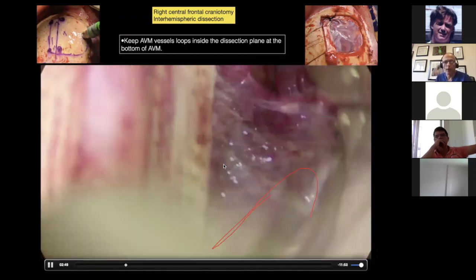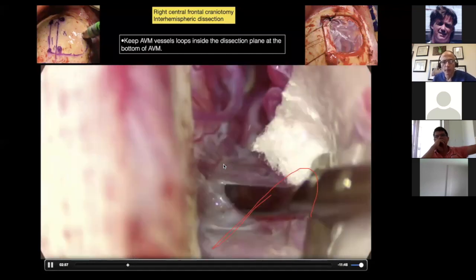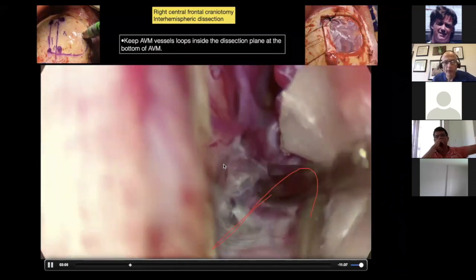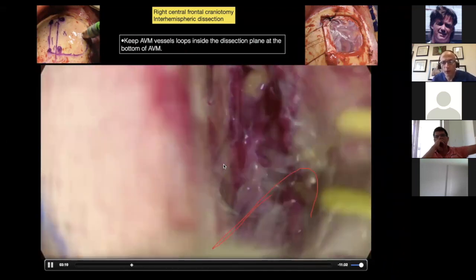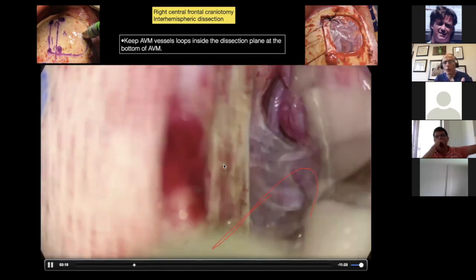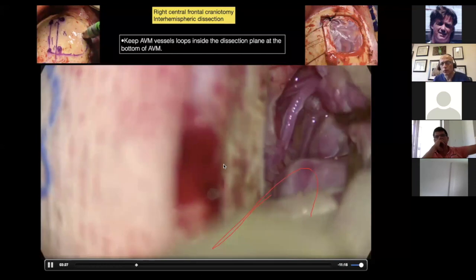Okay, now we are free more. It takes time. But if you go to the lab and do this, peeling and cleaning the pia arachnoid of the cadaveric brain, you develop this tactile sense, okay? That's what I did when I was resident or fellow or doing nothing. Even now, sometimes I go to lab and clean the brain. It keeps your skills up. And these skills for AVM, or insular glioma surgery or brainstem surgery or aneurysm surgery or skull base meningioma, are similar skill sets.